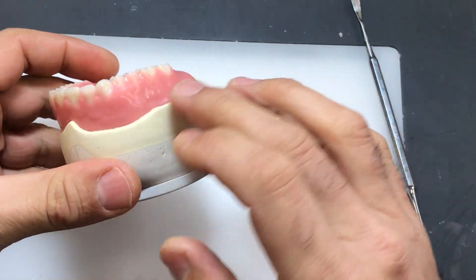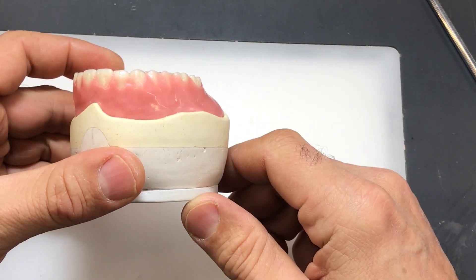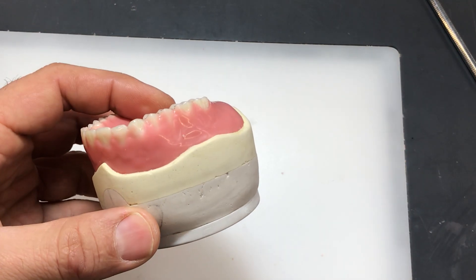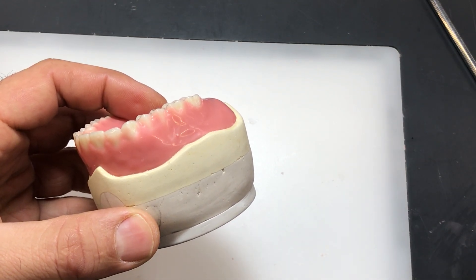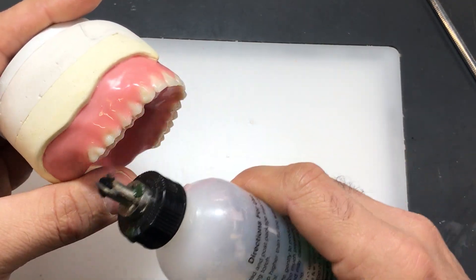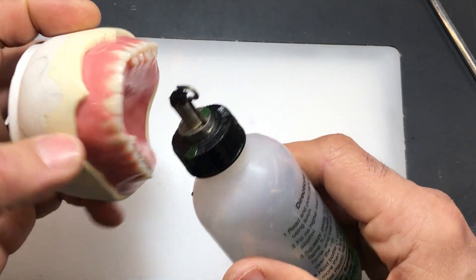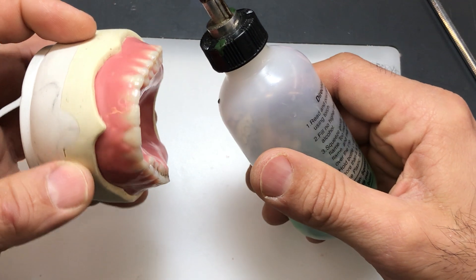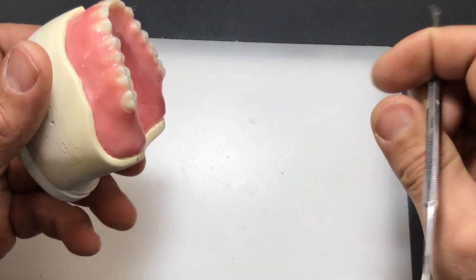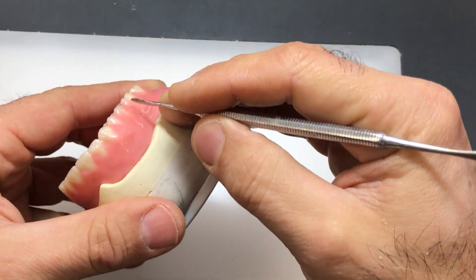Before you start carving your wax, just soften it a little bit because depending on the type of wax you're using, some waxes are really hard, like the one we have here, which is great for carving and creating natural contours. One way to make the initial carving easier is to take your alcohol torch and gently flame around the margins. Just heat up the side that you're going to start with. I'm right-handed, so I typically start on the first quadrant and make my way across.